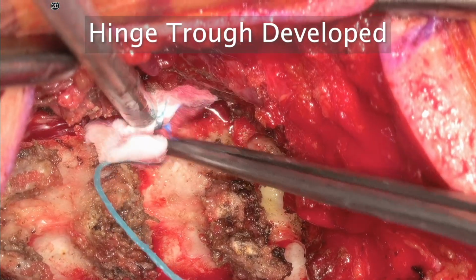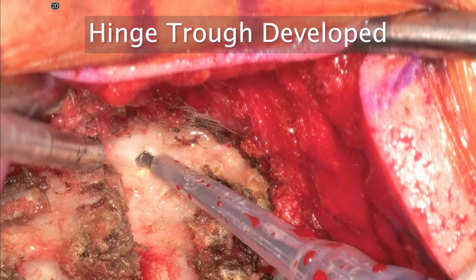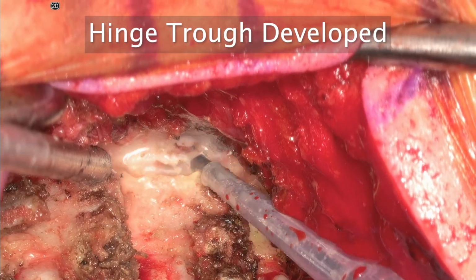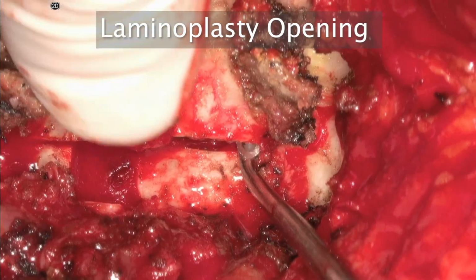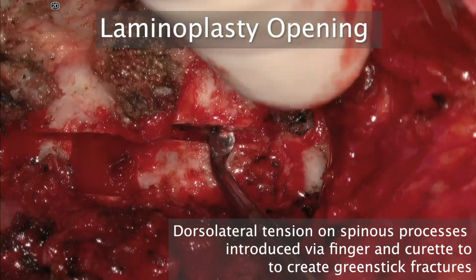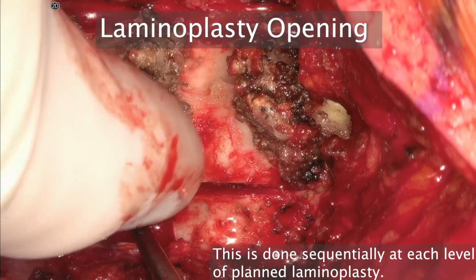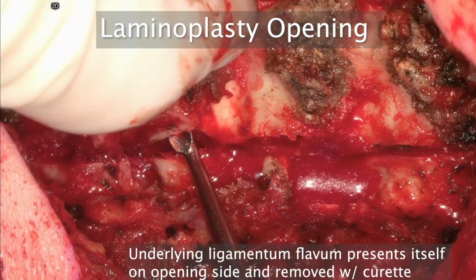Talk me through the technique for elevating the lamina in a safe manner to avoid spinal cord injury. As you can see, our surgeon is placing his thumb on that spinous process, as well as using an upgoing curette to gently introduce some tension as we're creating that green stick fracture. However, this is all in a controlled manner so as not to introduce a complete fracture and therefore destabilize this laminoplasty that we're working on.